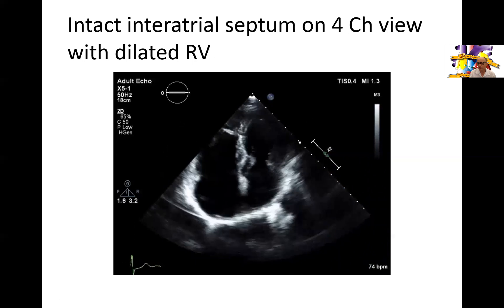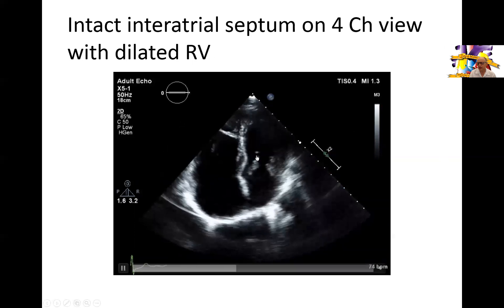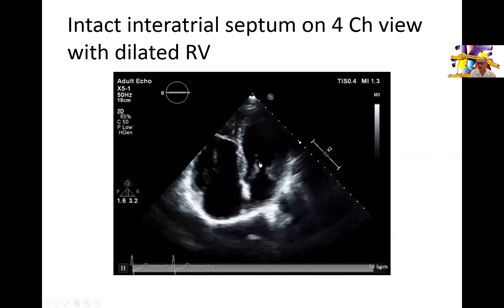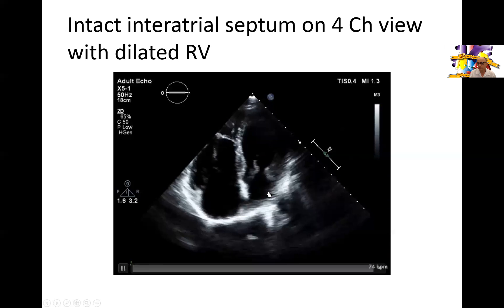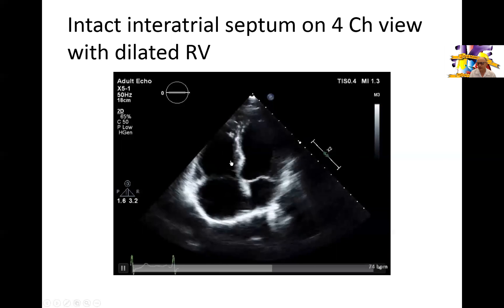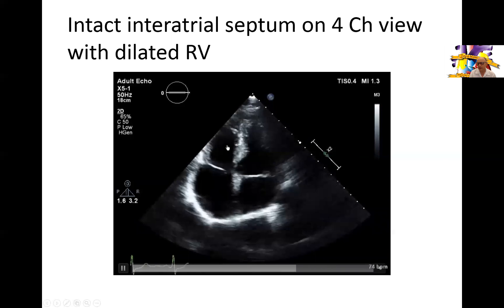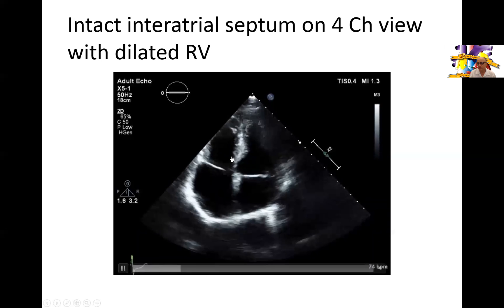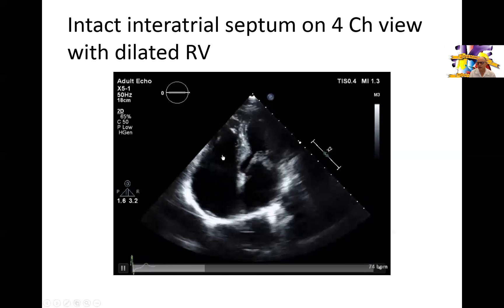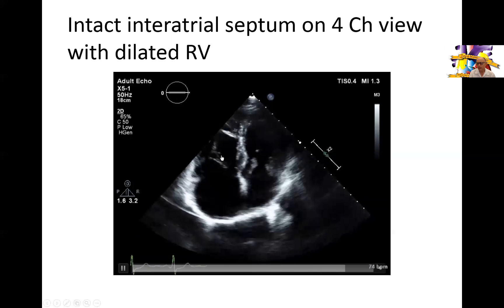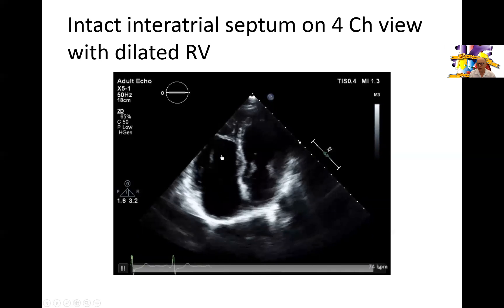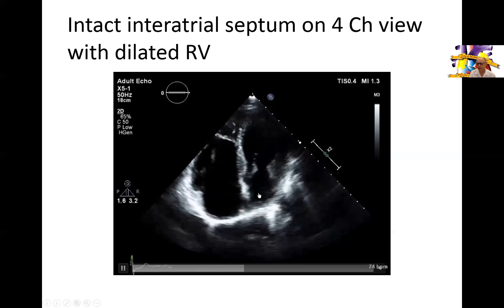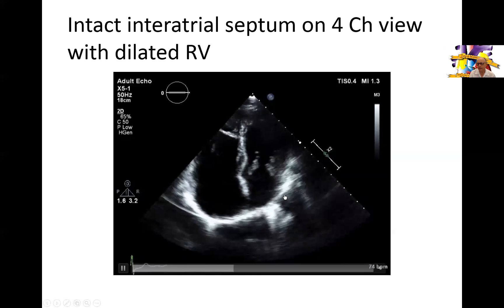In the apical four chamber view you can see normal left ventricular size and systolic function, normal left atrial size, but the right ventricle is as big as, if not slightly bigger than, the left ventricle, indicating right ventricular dilatation. The function is normal or slightly reduced, and the right atrium is dilated — bigger than the left atrium.